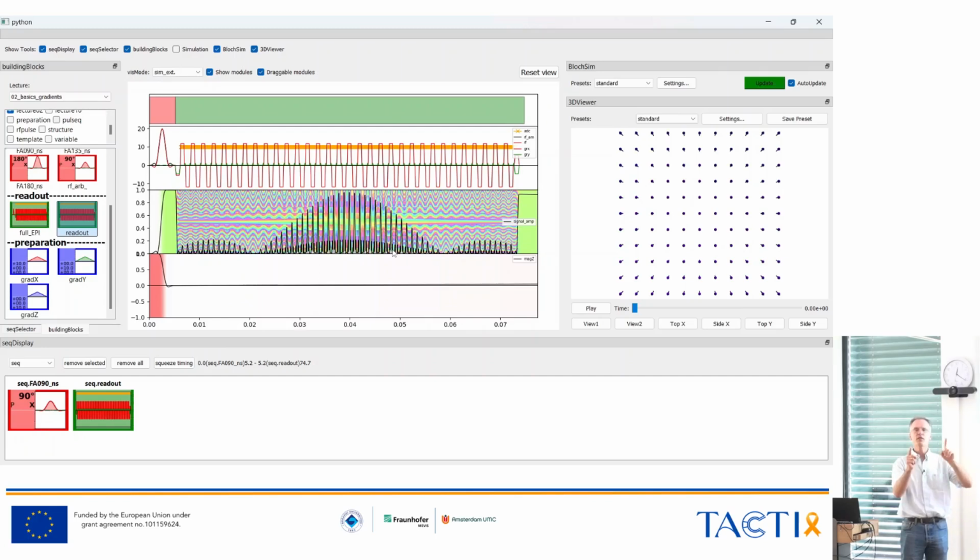And so even though one is precessing much more quickly than the others, there's always a point in time where they all will show in the same direction. But physically, they have accumulated a lot more additional phase, as we call it, yeah. So that you would be getting this artificial echo, and it's a so-called aliasing effect of the simulation.